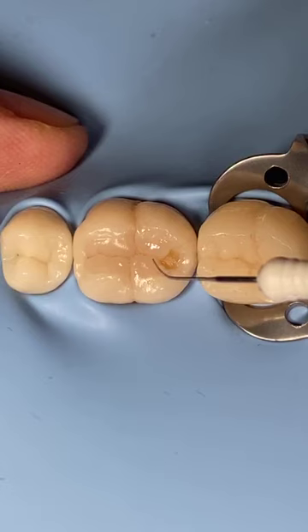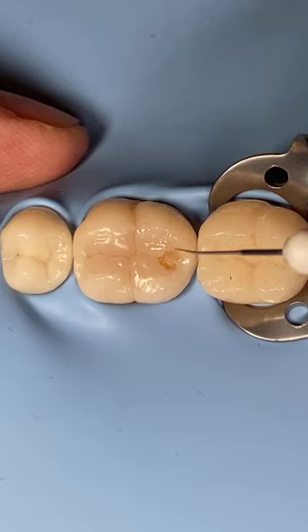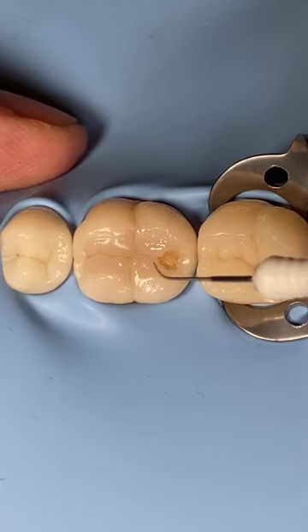Don't worry about the big gaps. Don't worry about anything. Everything is going to be okay. Make sure that you have good space for the distal cusps. Mau bilang distal, aduh. Maklum ya, ini lidahnya lidah Jawa Barat. Okay. Draw, just create a draw here.